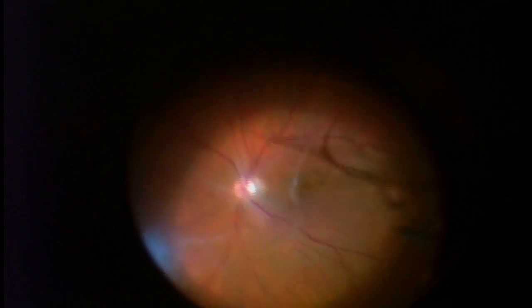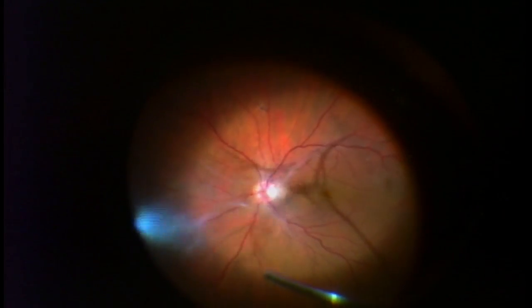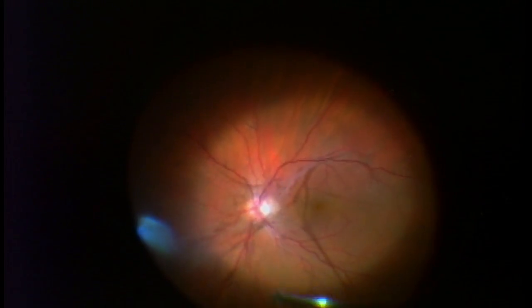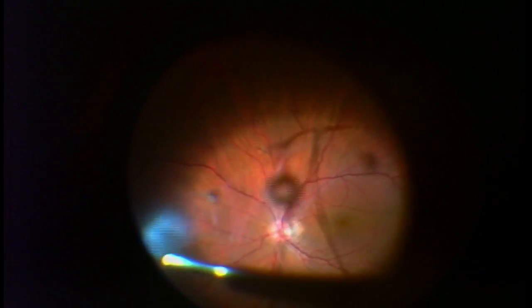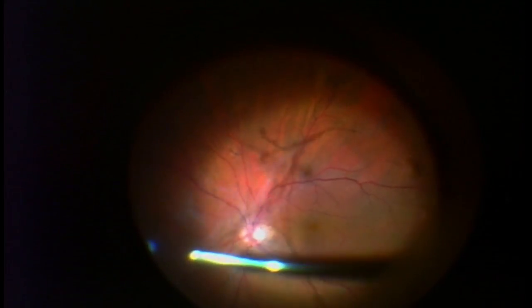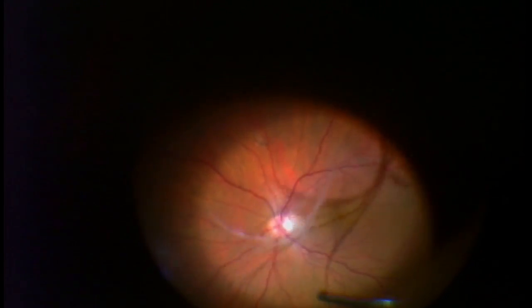So the retina is the inside lining of the eye. It captures light, transmits it through the optic nerve to our brain to produce vision. In patients with opacities or floaters, the vitreous contains some elements which actually absorb light and cast shadows on the retina, as you can see here. And again, those little round bubbles are actually just bubbles of air that get mixed in during the operation almost every time.